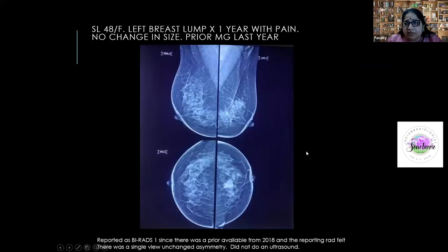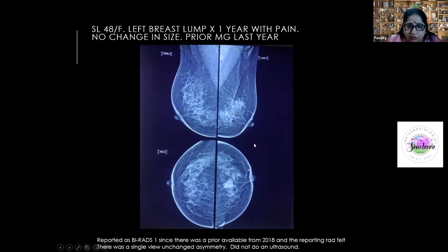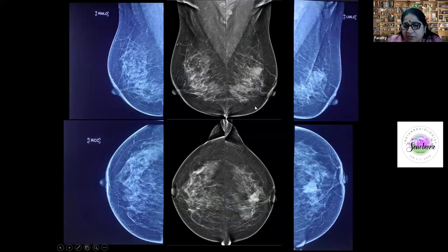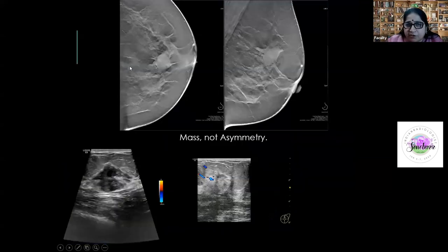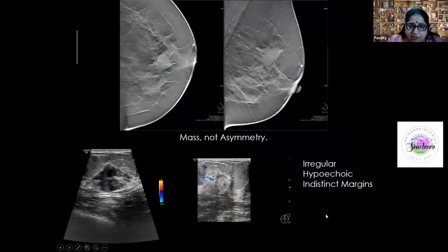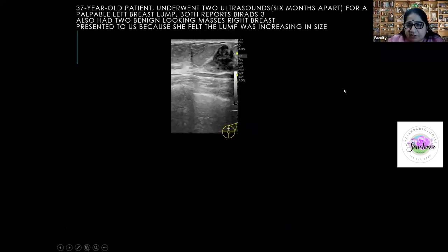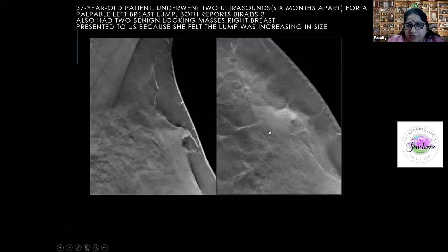Change is important, but no change should not lead to complacency. This finding was reported as stable BI-RADS 1 from outside, with four prior stable mammograms. We said: even though stable, it is suspicious — irregular with spiculated margins and suspicious on ultrasound. Irregular morphology trumps stability. If you have a suspicious finding you must biopsy, unless you already have benign pathology. This was an adenoid cystic carcinoma.